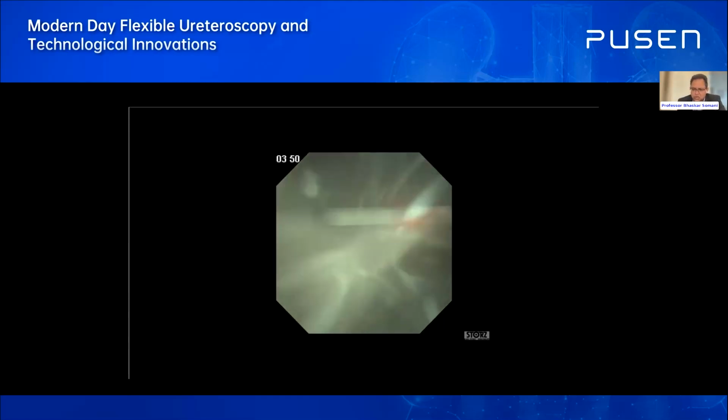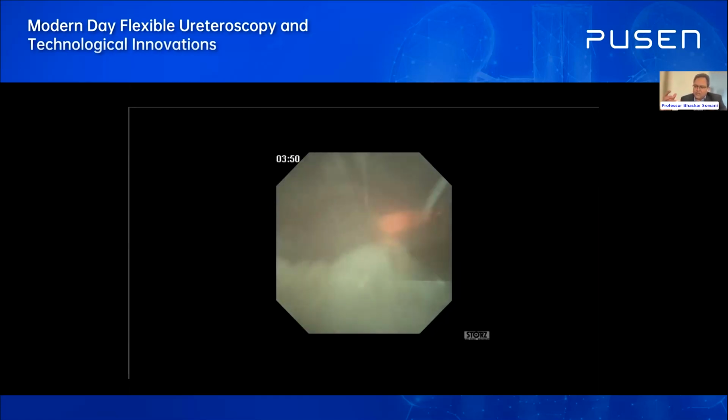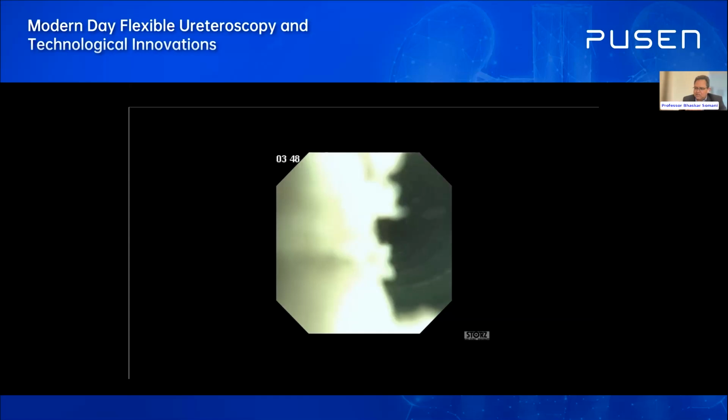Before I go to show you that case, you can see there's a lot of debris and dust. And actually, once you have done it, normally for that quantity of debris and dust, you would expect the stent to drain it. You will not be able to suck it out because it's too much. But with a suction sheath, you have the sheath all the way, and you will see at the end, once you have broken it down, you can move the sheath to wherever you want to, and it drains beautifully.